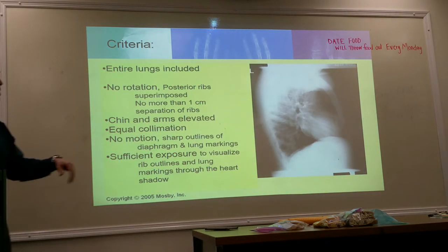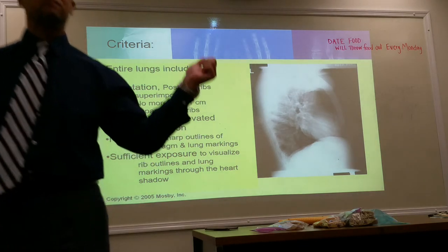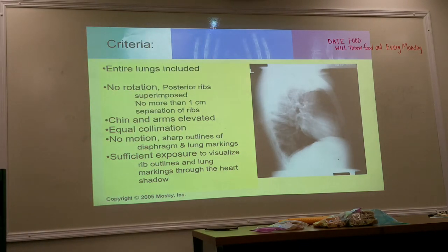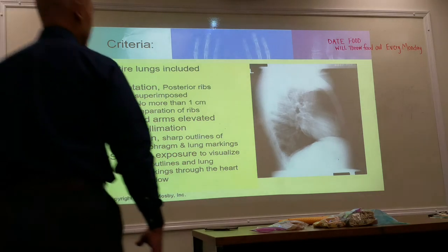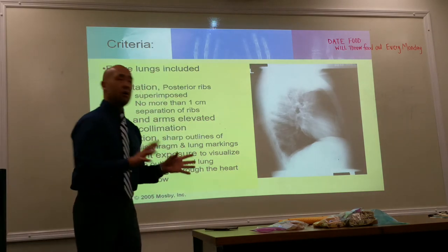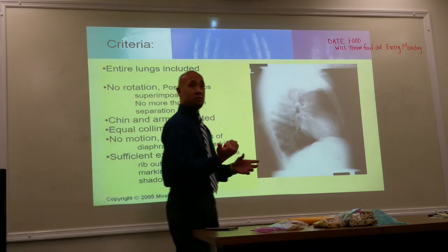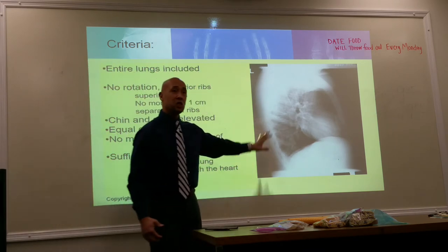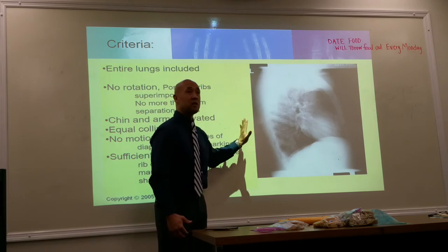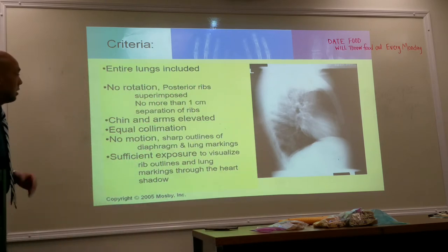Okay, same thing applies here. So even when you're doing the lateral, take a deep breath in, blow it out, take another deep breath in, blow it out. Now you're watching them. Okay, hold it, click. All right? Again, it's just natural that you're with the patient, but the moment that you step away, they think, what are you doing? And so they move and they want to see what you're doing. So make sure that they're not moving and they're following directions before you take that X-ray.